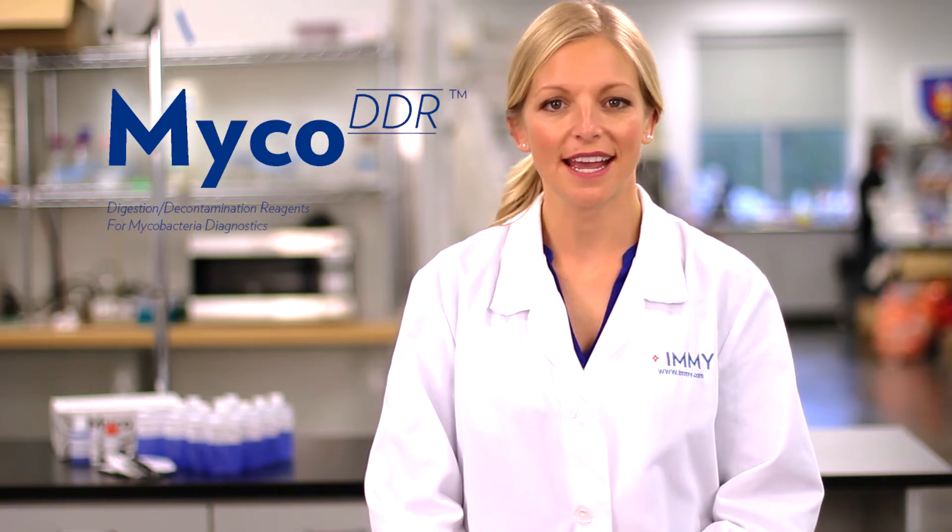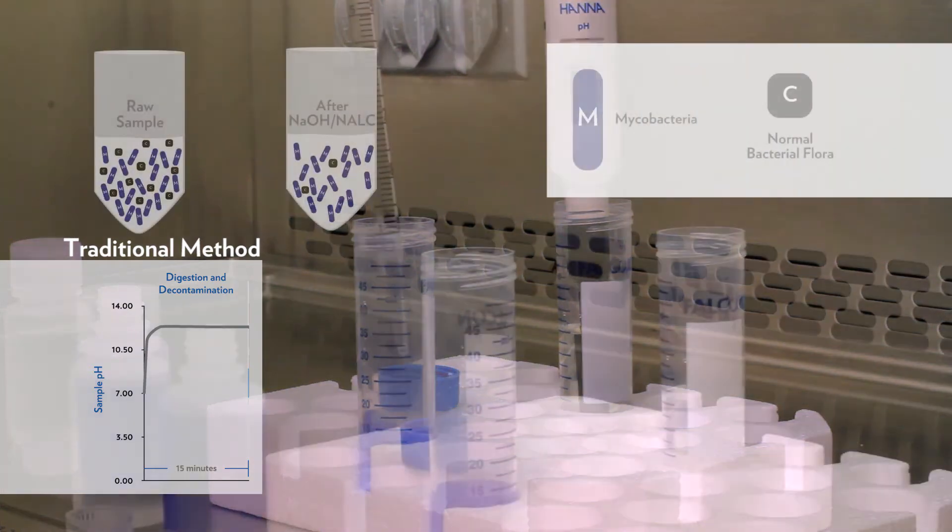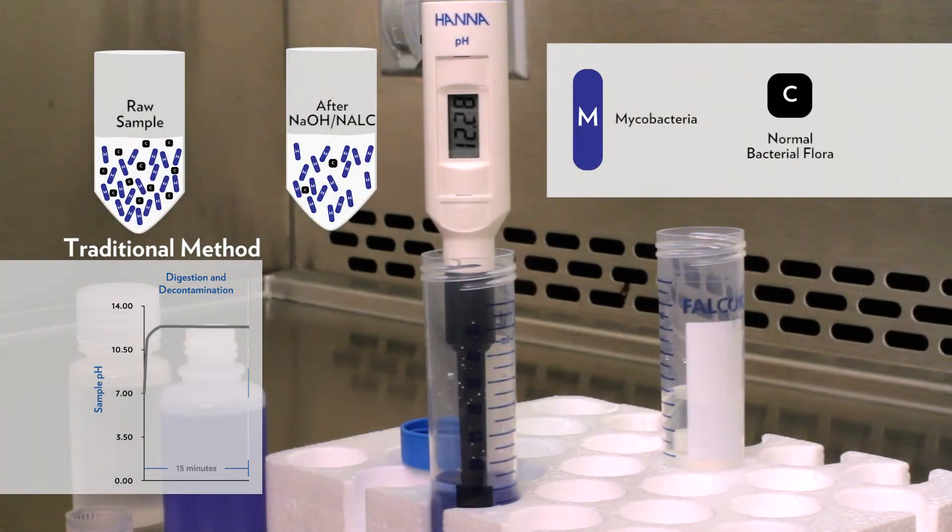The first step in the digestion decontamination process is to add a sodium hydroxide NALC solution to the sample. During this stage, the pH is elevated to properly decontaminate the patient sample by killing off any contaminant bacteria.